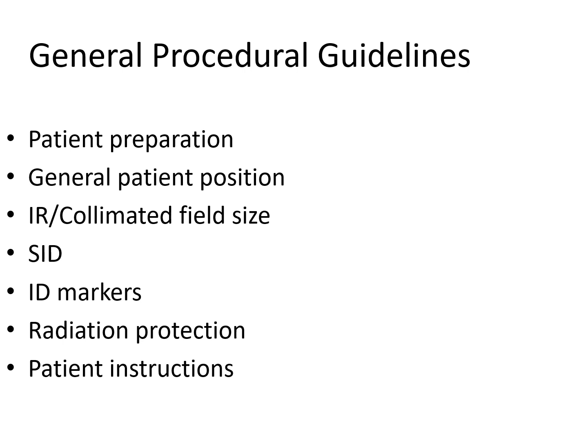So, when you're going to start a cervical spine procedure, we're going to do patient preparation. A lot of people like to wear jewelry in this region, earrings that dangle. It's sometimes stud earrings, especially on the lateral cervical view, can get in the way. Best practice is to remove all earrings.